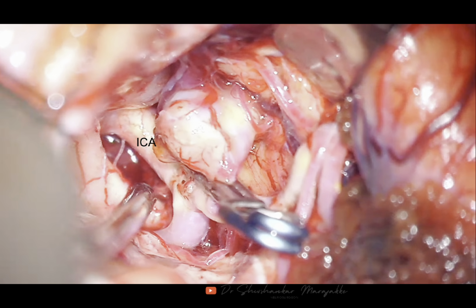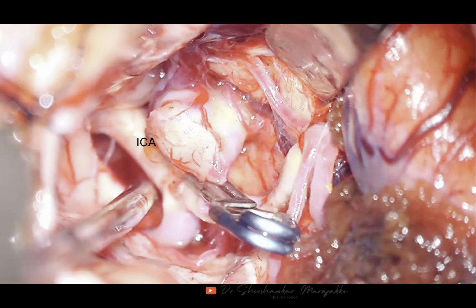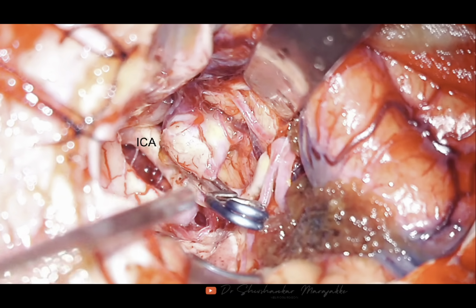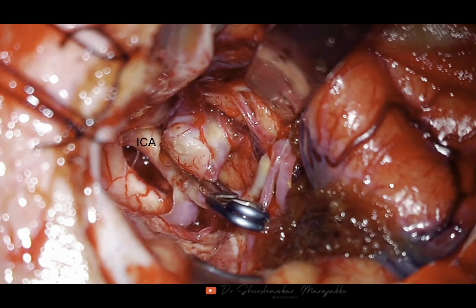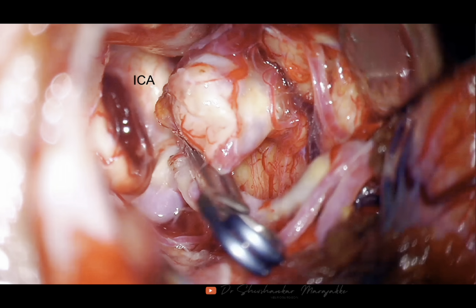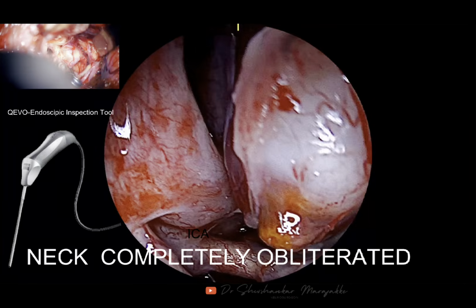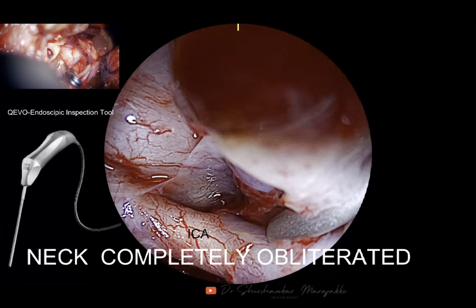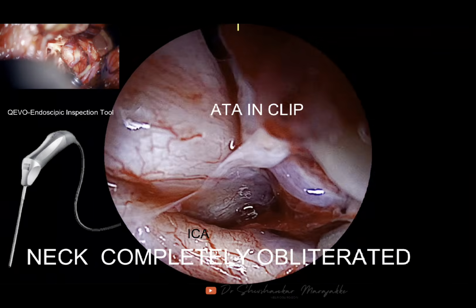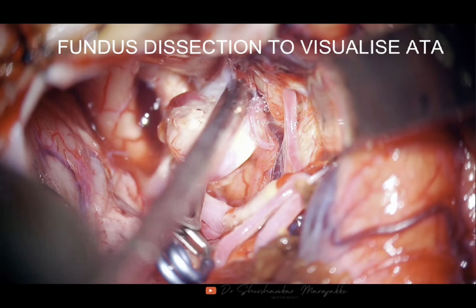So after this, the aneurysm is completely obliterated, the neck is obliterated, and the aneurysm is not filling in this case. But I am doubtful about the antetemporal artery, which is quite big as I thought in the pre-op images, and even in the intra-op images here. You can see this is the tip using the endoscopic inspection tool. I see that the antetemporal artery is in the tips of the aneurysm clip blades.